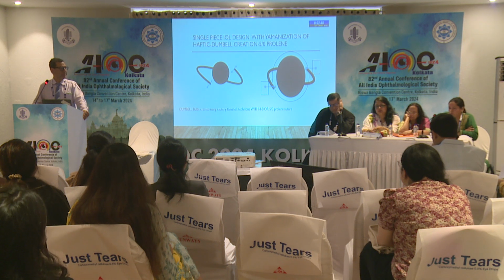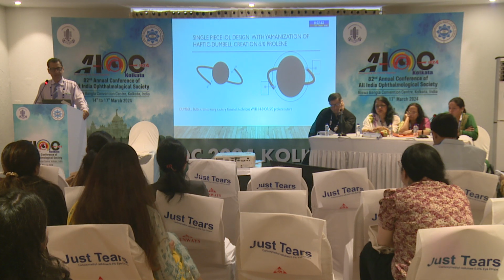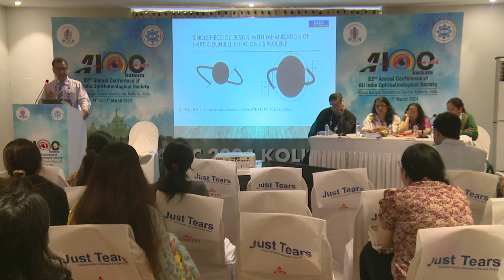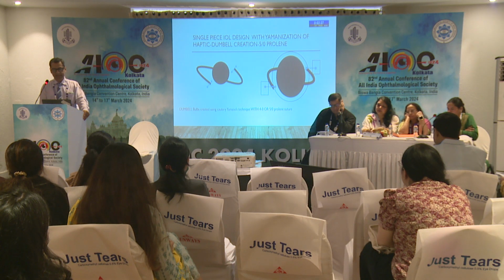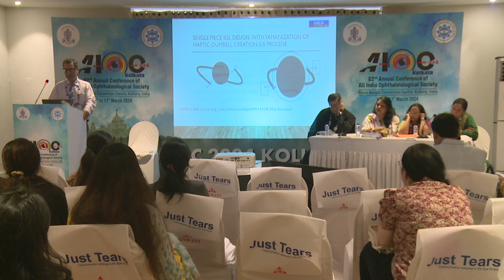So this is how the lens is fashioned. It's a single piece lens with flanging of the haptic, where you create a dumbbell with 5-0 Prolene outside the eye rather than inside. So you have a lens which you have created on the table when you have that complication, and you can create these two bulbs. One bulb holds the haptic inside the eye and the other is exteriorized to give transscleral support.